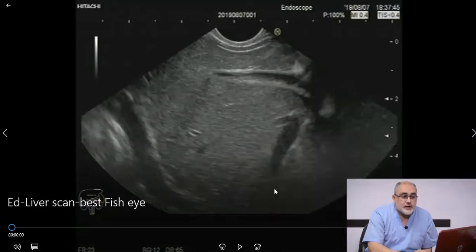In this short video, we will examine the liver systematically, which is very important in every US examination, especially for cases with intra-abdominal or intrathoracic malignancy. Our landmark is the inferior vena cava and the insertion of the right hepatic vein inside the inferior vena cava.